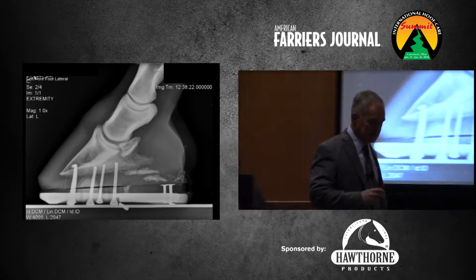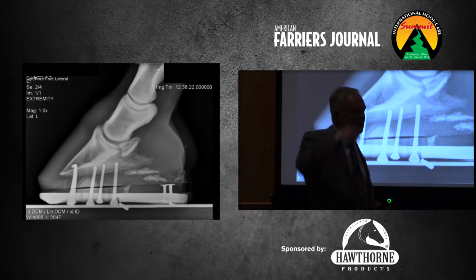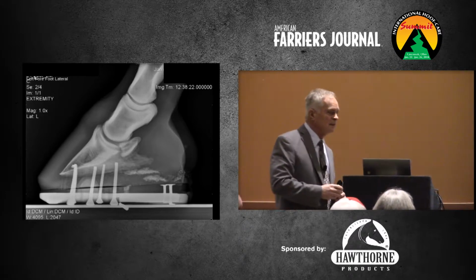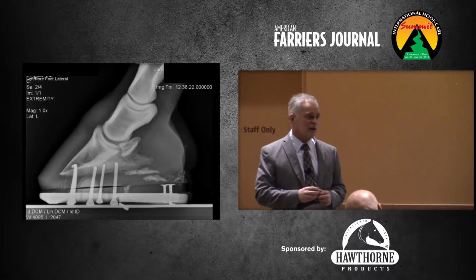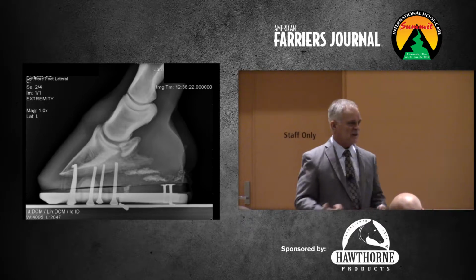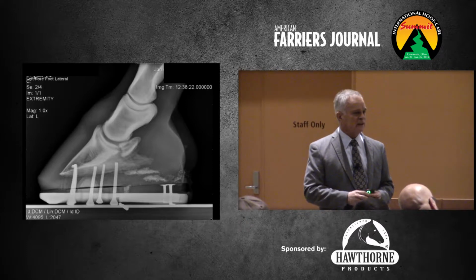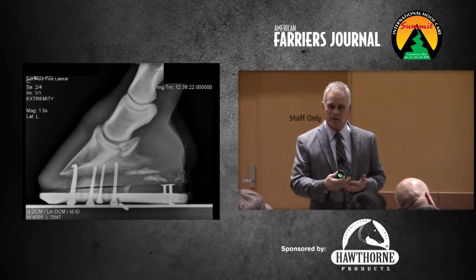Yeah, that horse specifically did not resent hoof testers, probably because the lesion was a little bit higher. Yeah, I'm guessing. Those are the kind of things that MRI has just really helped us with, because in the old days that horse didn't respond to point pressure. He was just lame, and obviously he did something when he jumped out and ran around, hurt himself.